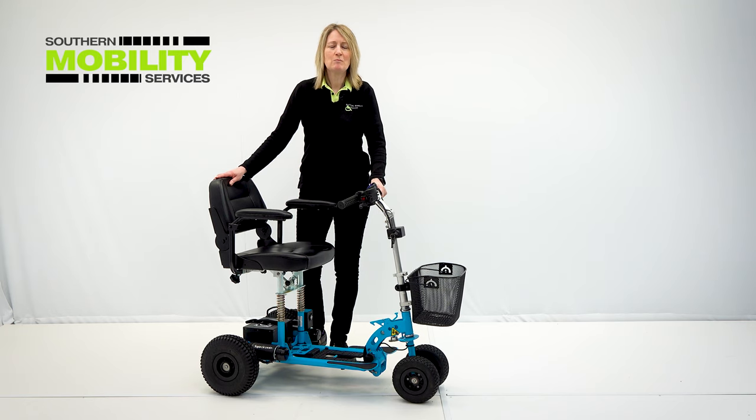Hello, my name is Tracy from Southern Mobility Services. In this short video we're going to take a look at one of the most versatile portable mobility scooters from the Super Scooter range. Today we're going to look at the Super Scooter Sport HD.